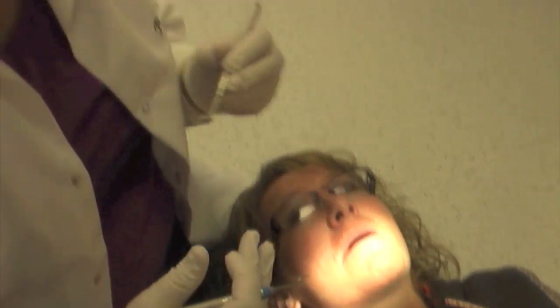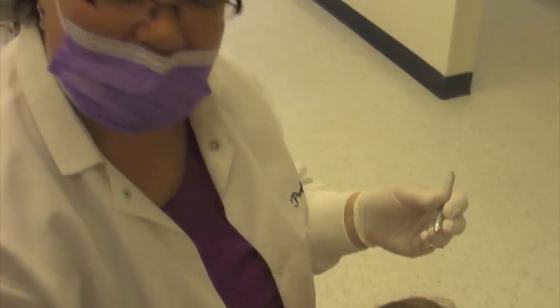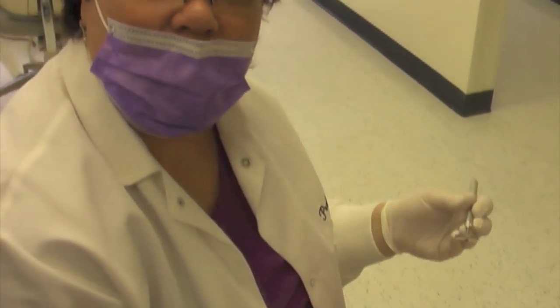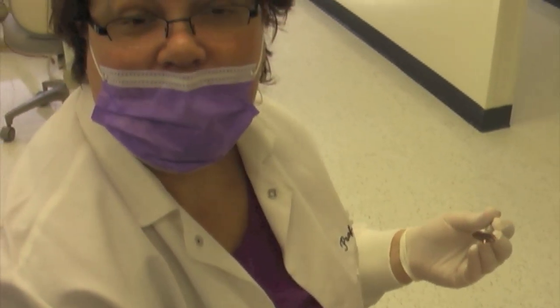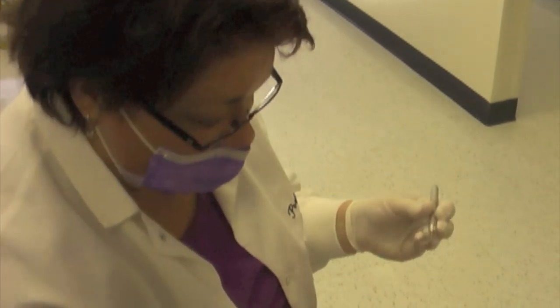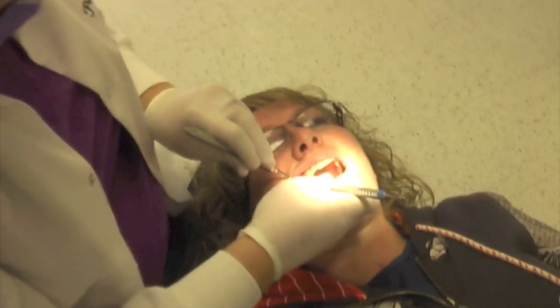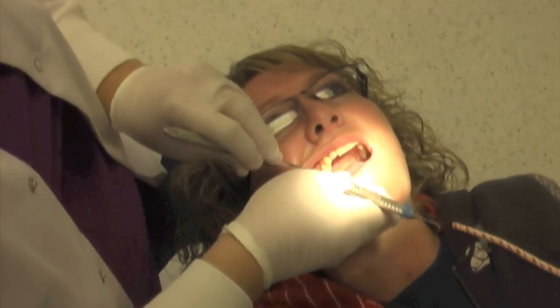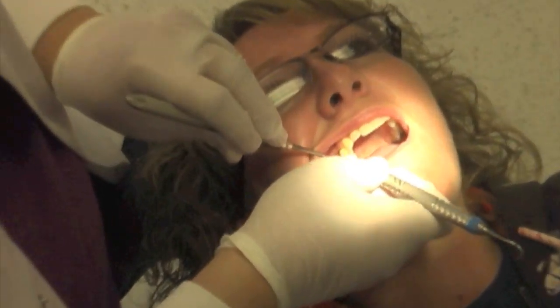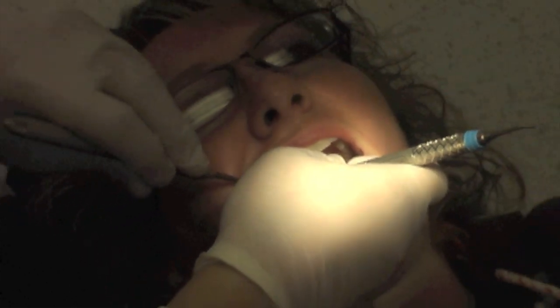Remember, if you're starting to feel strange — like you can't gain access and it feels very awkward — it's probably because you're in the wrong patient-operator position. When you get to the premolars, you can come to like 9 o'clock because you can get the correct lateral pressure from both sides sitting at that position.